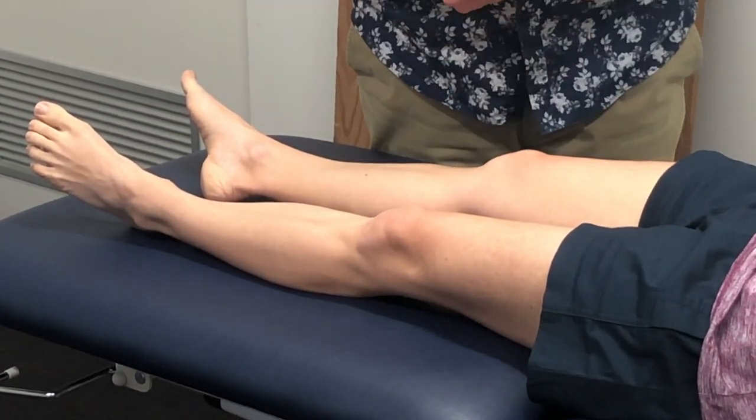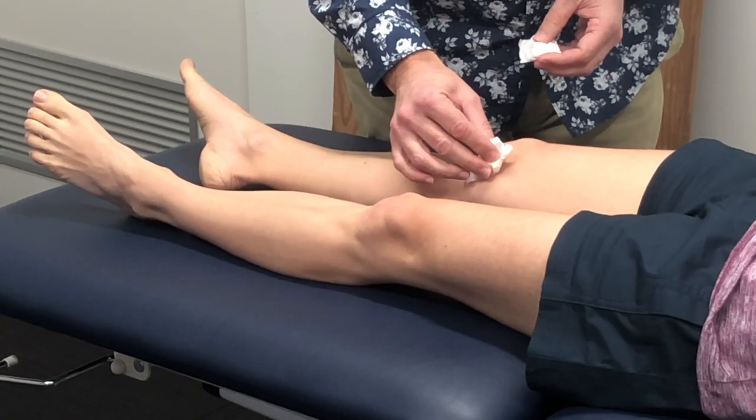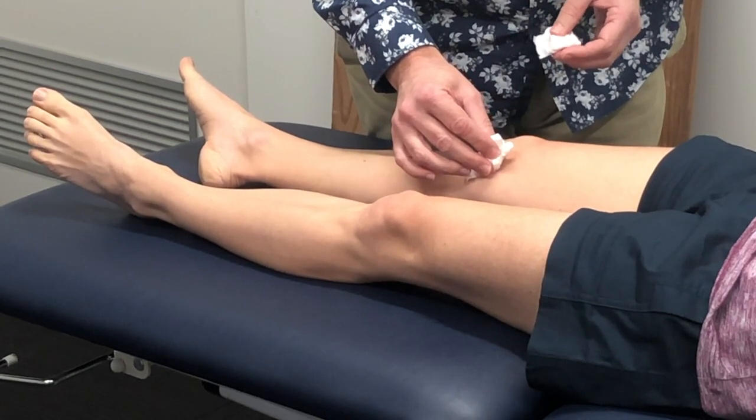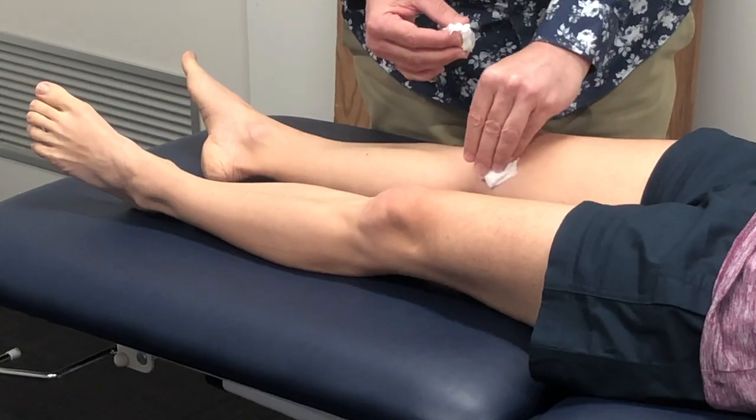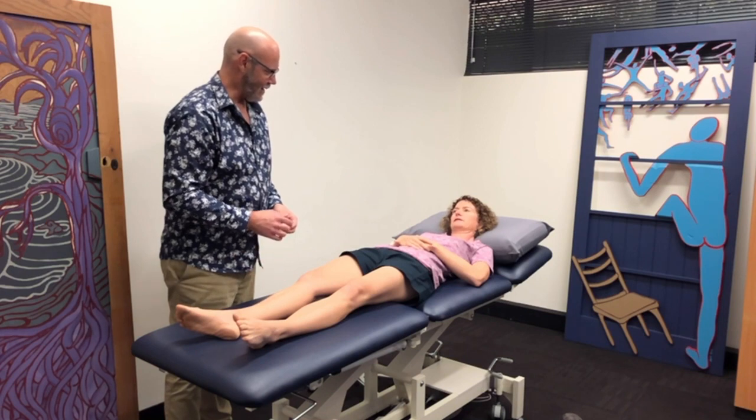So now I'm going to go to this knee. You ready? Yep. So I'm just going to hold that. That's — yeah, that's really uncomfortable. And where are you feeling that? That whole area under my knee — I can kind of feel it go down my leg. Spreading the pain down your leg.